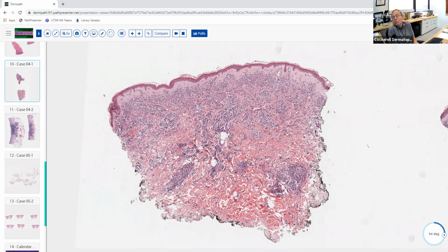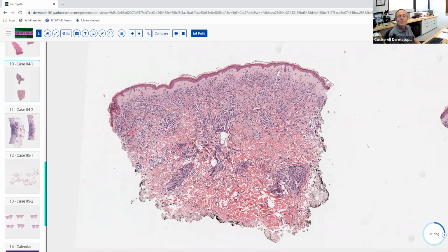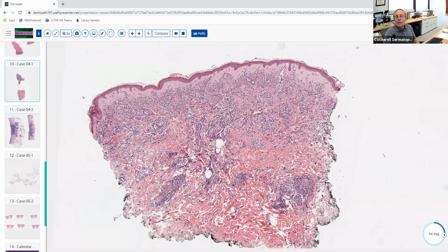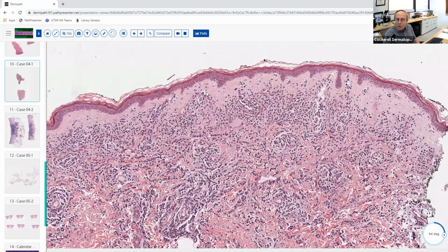You may not know. I know it's like the collagen layer in between. Is it named after Dr. Grins, or where did the name come from? It's actually the German word for frontier. It means like the border between one process and another. So we're talking about a Grenz zone.